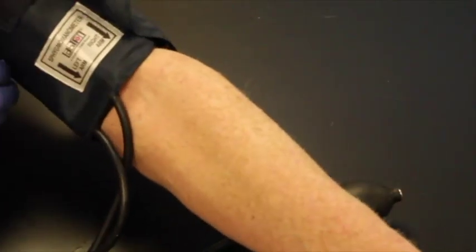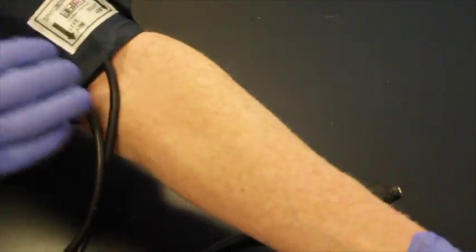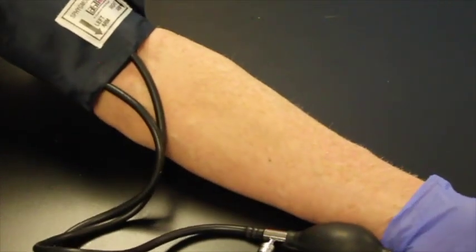And here we have little instructions, right? Left arm, put this right on the brachial artery. So my brachial artery is right there.